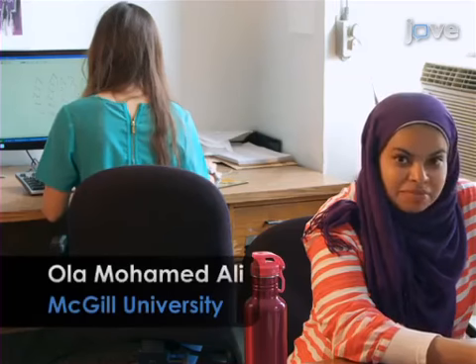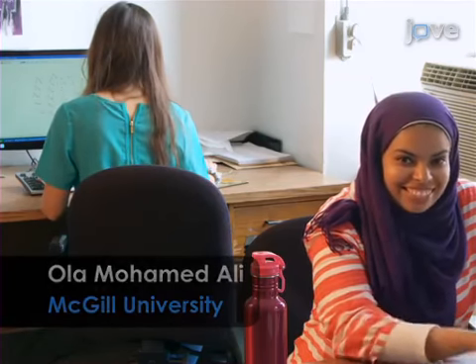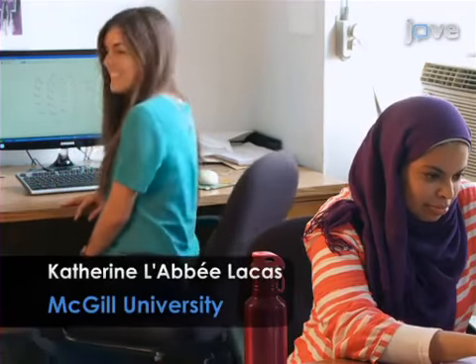The visual demonstration of this method is critical because the technical steps are difficult to master due to the numerous details involved that, when carried out incorrectly, can jeopardize the interpretation of the findings. Ola, a graduate student of my lab, will be demonstrating the procedure, and Katherine, my research assistant, will be acting as a participant.